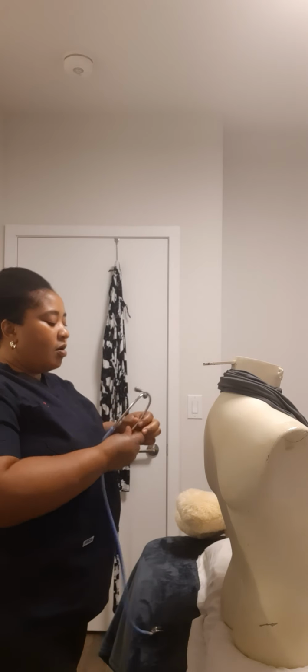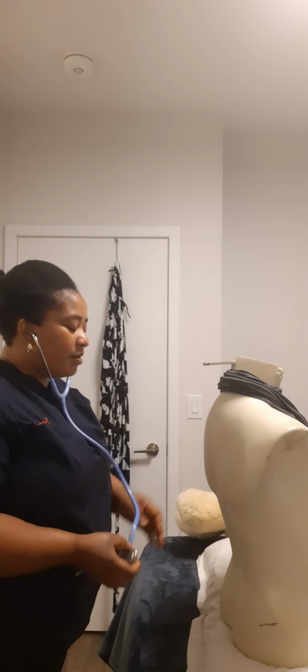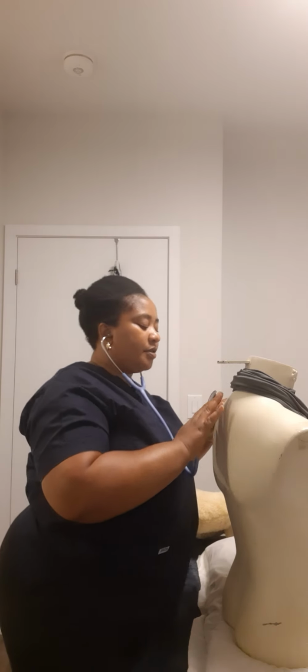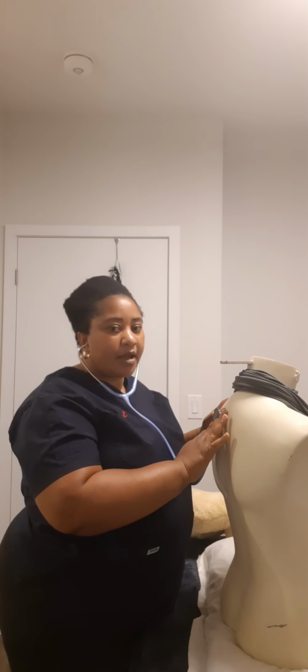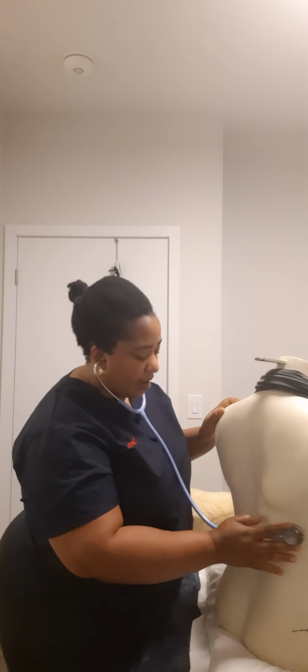So for the auscultation of the thorax, I'm going to be asking you to take a deep breath. Please, take a deep breath on each spot. I put my stethoscope in and out, in and out.